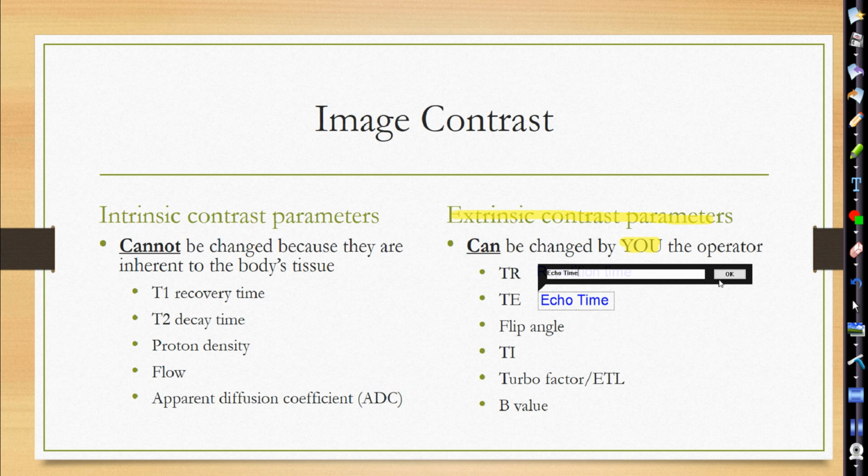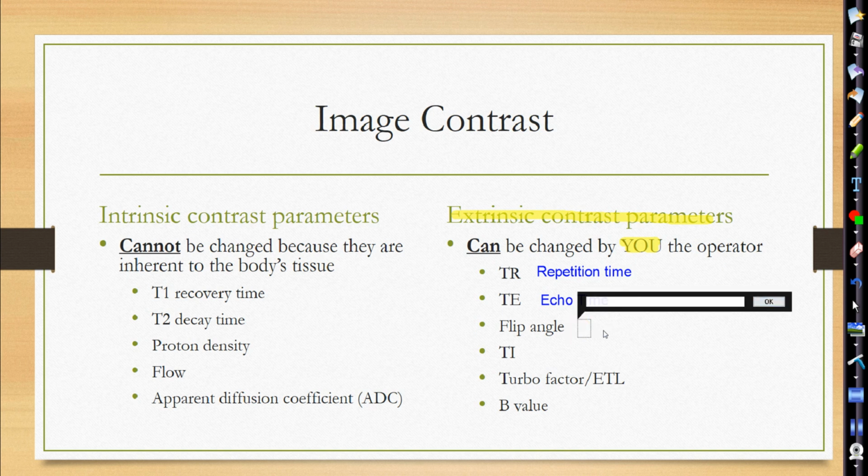Yep. So we can just put here, just as a reminder, determined by amplitude and duration of RF pulse.